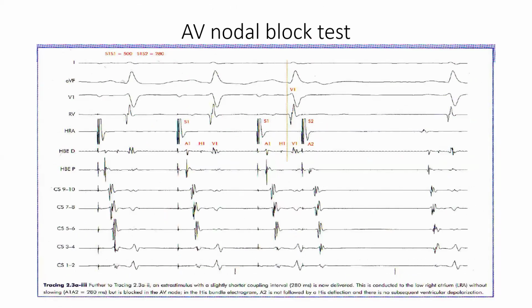So it's just to emphasize what we are saying here. So let's look at this one too. So remember we said when they start pacing, it will look like a box, right? So you see that box? So they've now helped us to label it S1, right? So Dr. Bassi, I'm sure you'll be willing to take this one. So what did you notice?